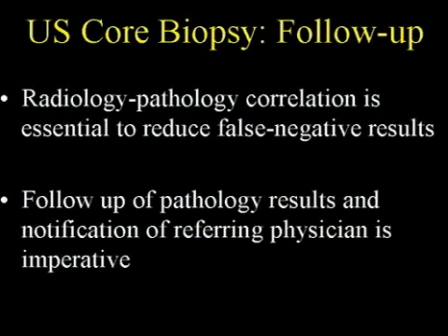Okay. Very important then is follow-up after biopsy. At our institution, it takes about 5 days for the results after a core biopsy. So after these results are in, it is important for the radiologist to go back and look at the original imaging findings to make sure that it corresponds with pathology. Also, it's important to have a system in place to make sure that all pathology results are followed and that the referring physician is notified. You need to make sure that none of the pathology falls through the cracks.